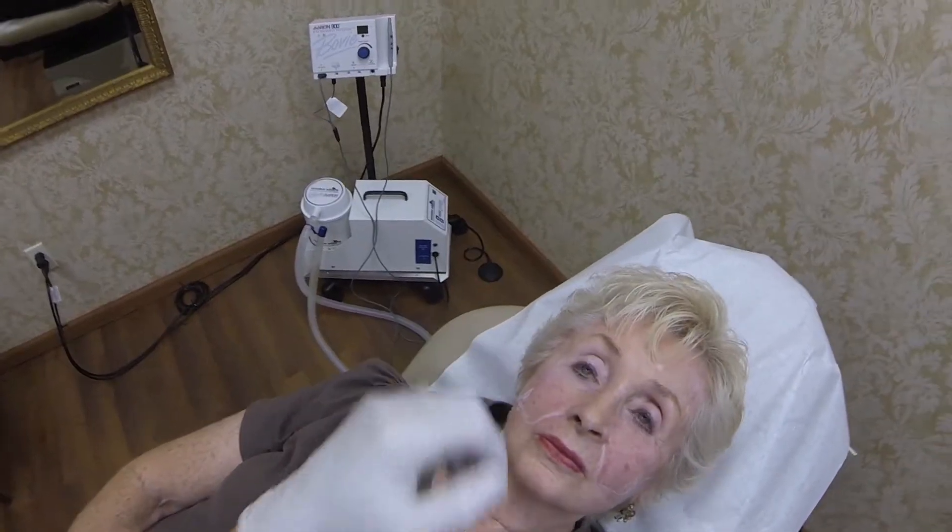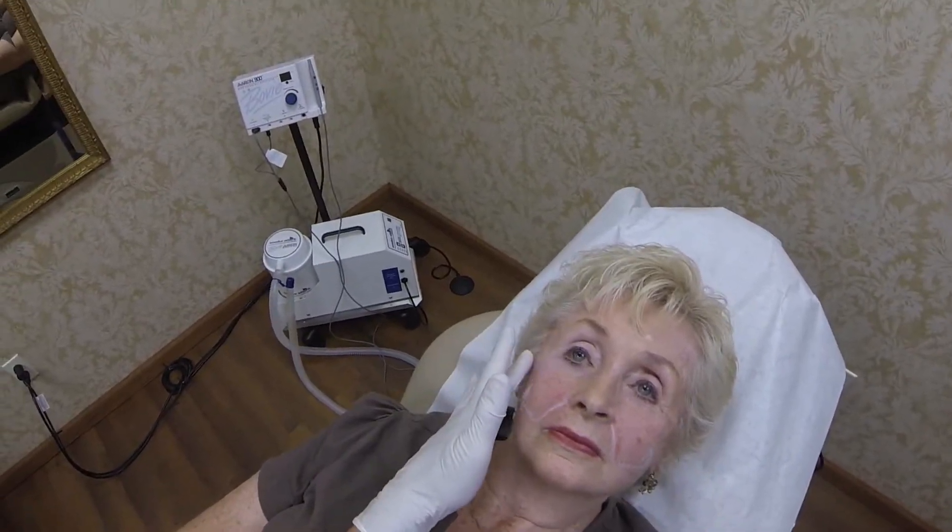I'm going to put one half syringe of the Radiesse here, deep; one half syringe of Radiesse here, deep; one half syringe of the Juvederm Voluma here, a little bit more superficial; and the other half syringe of Juvederm Voluma right here, more superficial. The right cheek has less skin because of the prior surgery than the left cheek, but volume-wise about the same — maybe a little bit more volume on the right side, which is tighter.